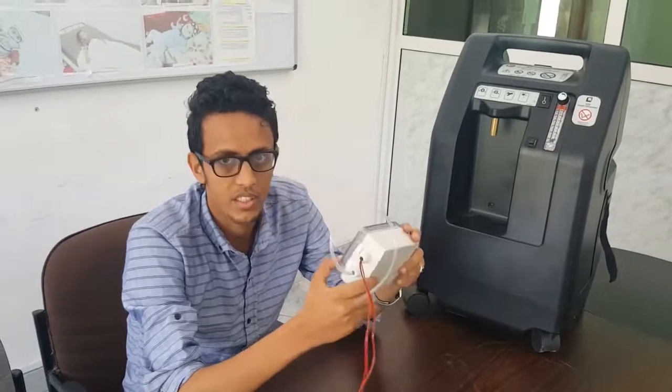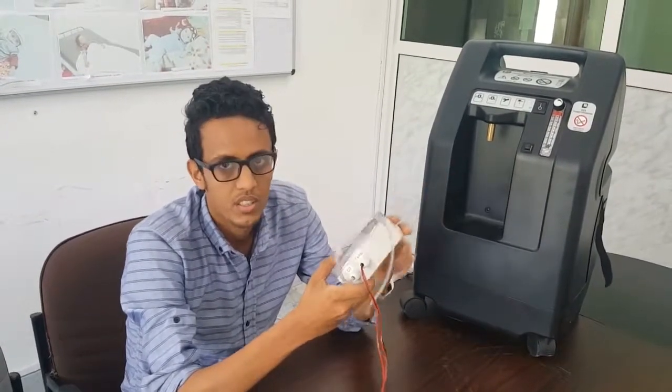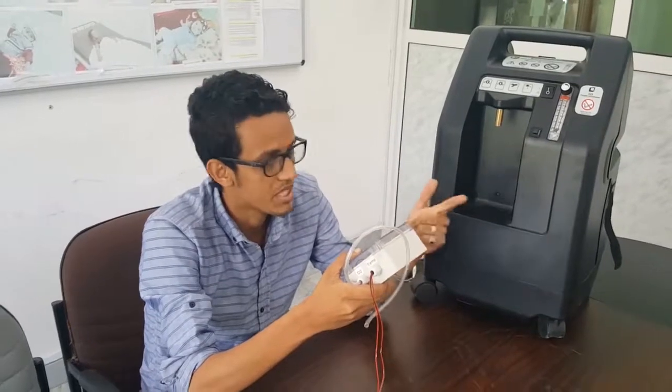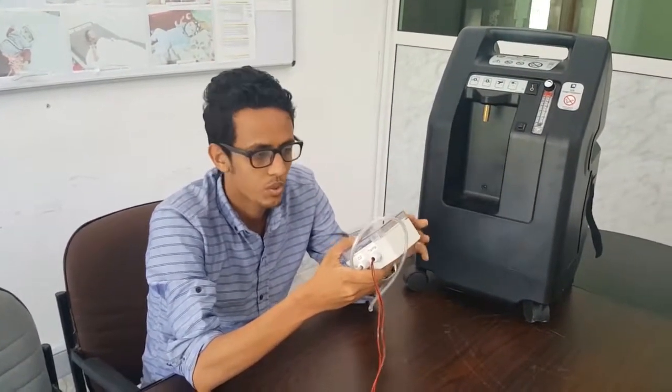We are going to connect this Internet of Things box with the device so we can check the performance of the device online. We will be able to monitor the oxygen concentration, the compressor temperature, the hour counter, and so on.